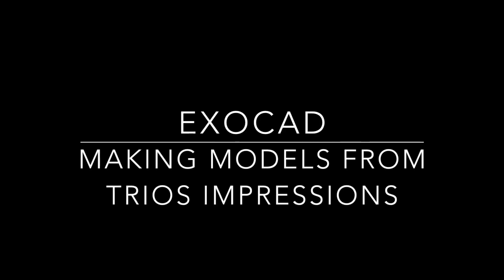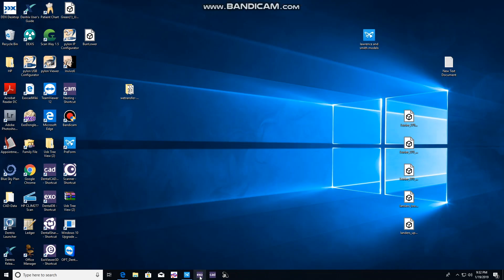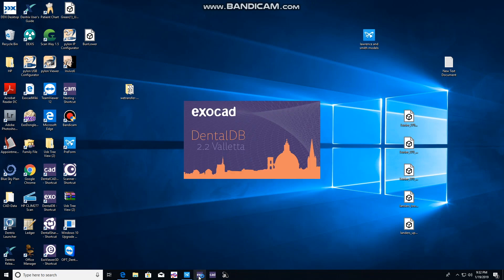All right, we're going to demonstrate how to make models using ExoCAD from Trios Digital Impressions.